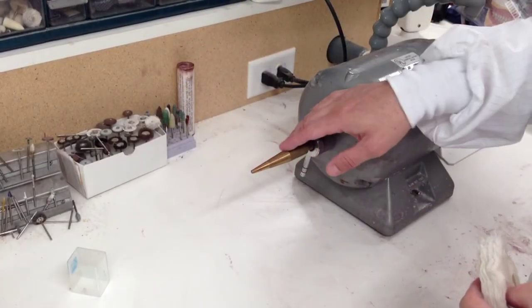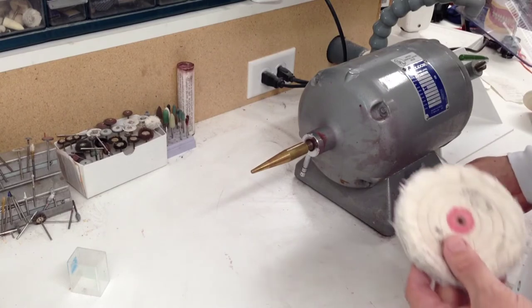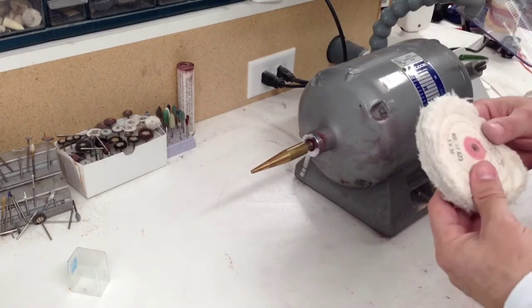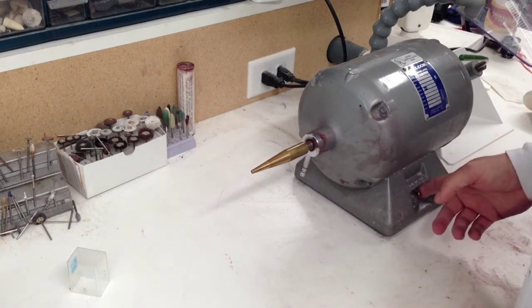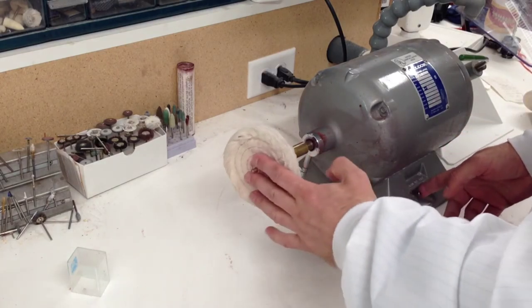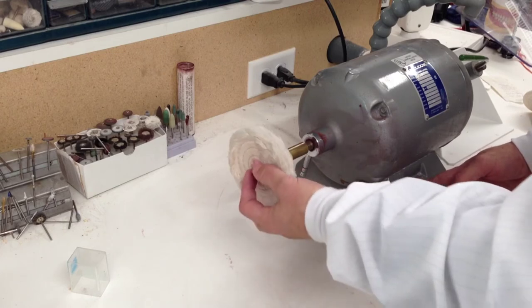On this tapered side of the lathe, you are going to use your rag wheel, which is used for polishing. You also have rag wheels used for pumicing. The way to apply the rag wheel is to simply put it on as far as you can.